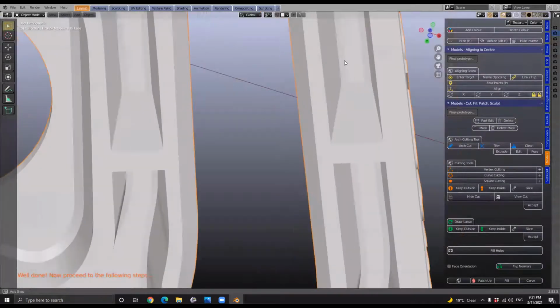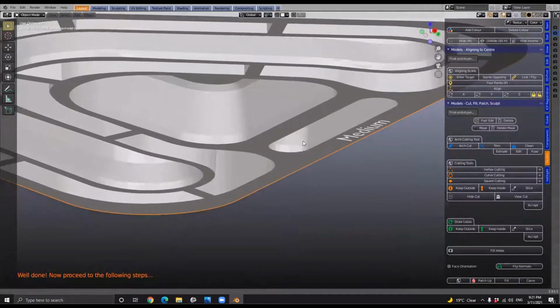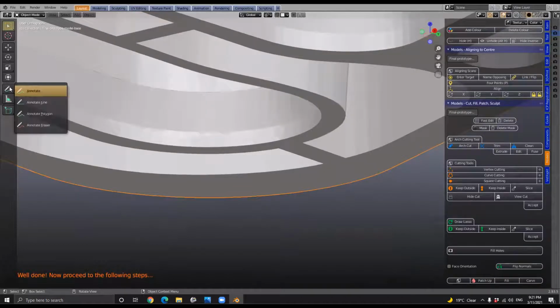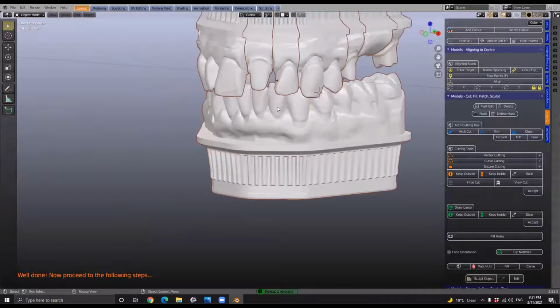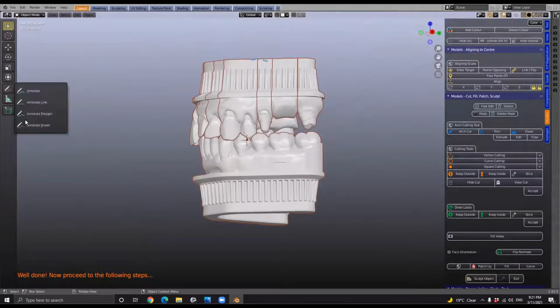Now, of course, with plastic injection molding, the plastic does give a little bit of way. So it's not that critical, I mean, of course, the crown has to retrofit on it, but we're not so dictated by every single micron of the resin expansion. So this is quite good. There's a bit of leeway that's given. That's quite clever. That's smart. All right. So yeah, I think that sort of explains the burn layer, doesn't it?